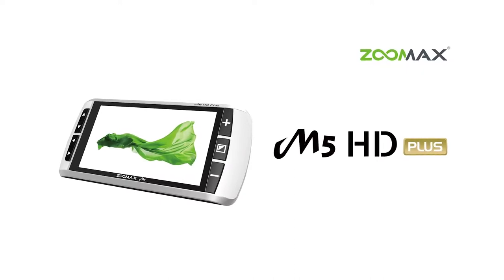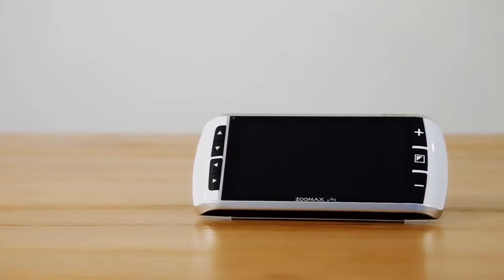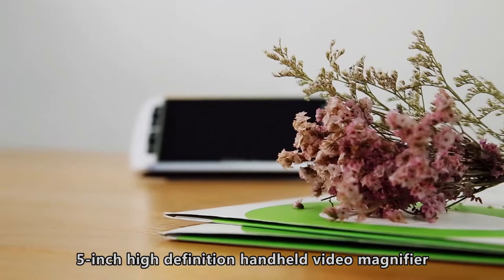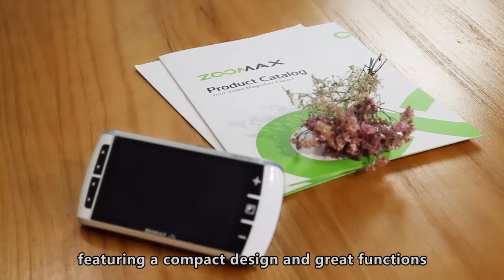The Zoomax Handheld Video Magnifier M5HD+. The M5HD+ is the up-to-date 5-inch high-definition handheld video magnifier, featuring a compact design and great functions.